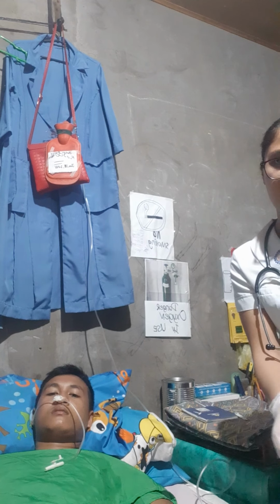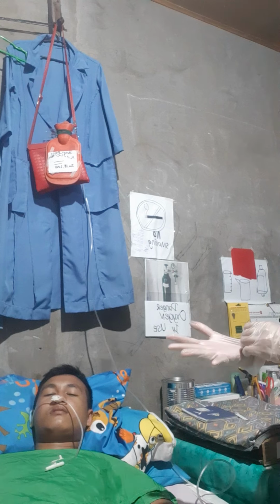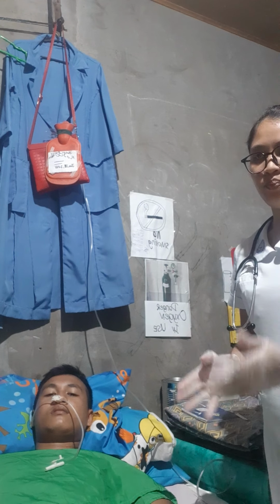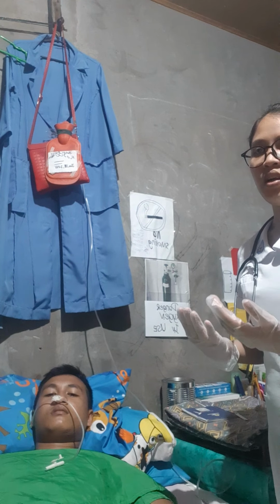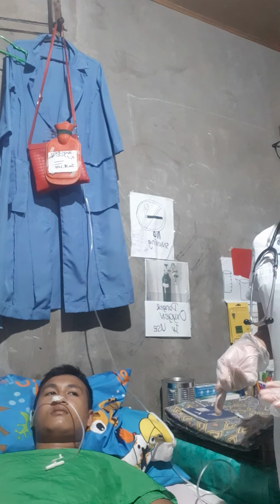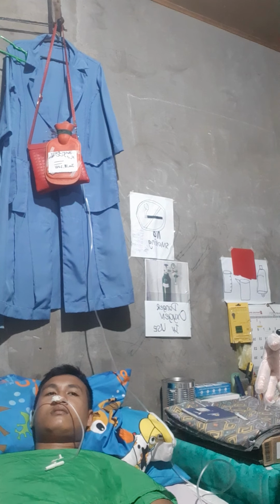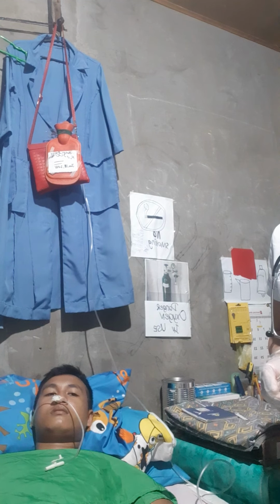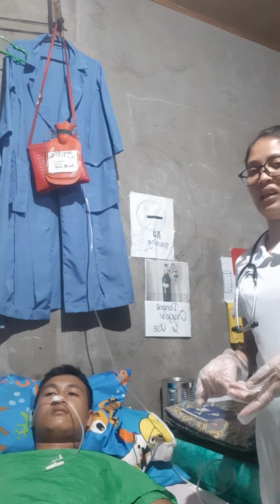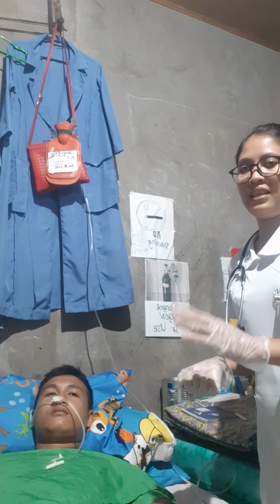Then after that, ask the client to take a deep breath before removing the tube, because this closes the glottis, to prevent accidental aspiration of any contents from the tube.